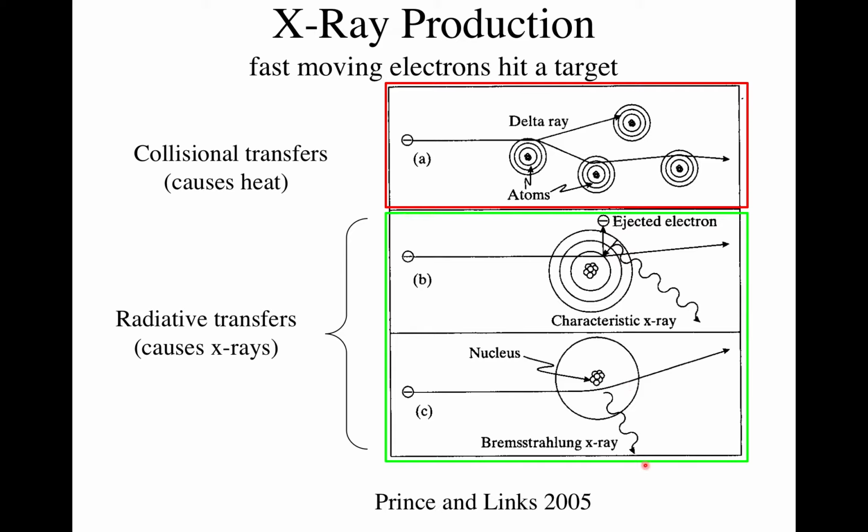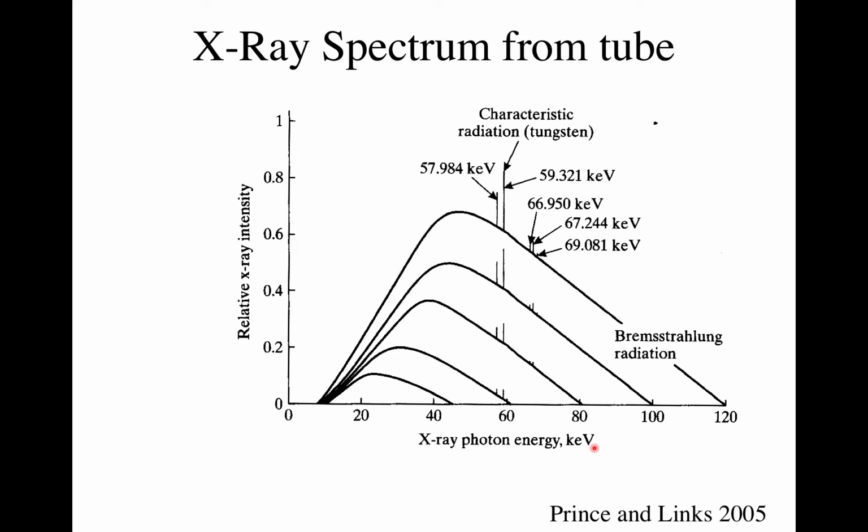Okay? And so a Bremsstrahlung photon is released, and these are released at energies anywhere up to the maximum possible energy. So if this electron, here's my nucleus, comes up and does like a 180, right into it, then you get the maximum release because, say, a 140 keV electron gets completely stopped, and then a 140 keV photon comes out. If it takes a hard break, a lower energy comes out. So we get a spectrum of photons coming out with this process. And this is what the spectrum looks like. Let's say we set our peak voltage on our tube to 120 keV, so I'm accelerating electrons across that gap between the cathode and the anode, and it's 120 keV voltage there.